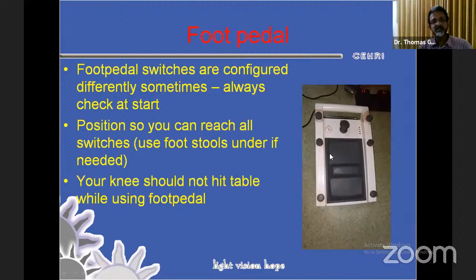The foot pedal switches can be configured differently. This is not a pre-configured thing. You can configure this switch to be the same as this switch and things like that. So always check your foot pedal before you start your surgery. You typically have a toggle switch like this for focus, one side going up, one side going down, but sometimes you configure it so that up is here and down is here. And this one has got a zoom and focus as toggle, and illumination switches are there on this. So you have to figure out. The only switch that's going to be constant is your XY. It's a joystick-like thing.